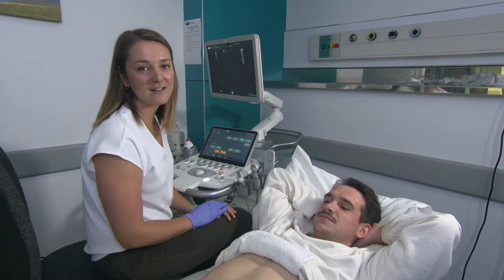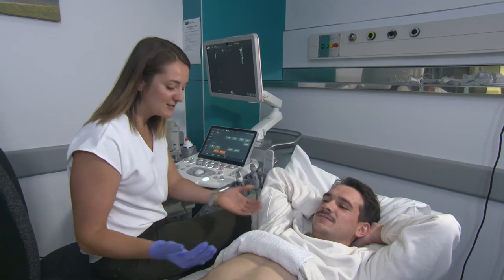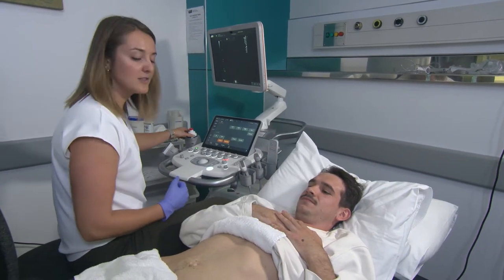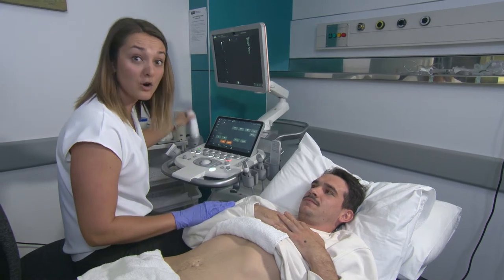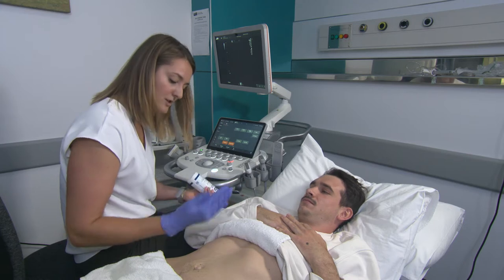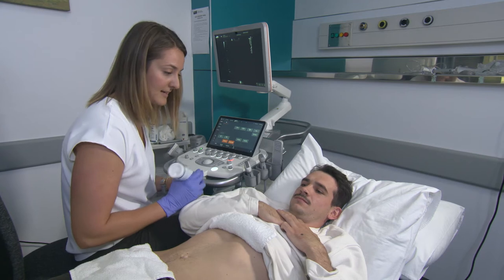Here we have our lovely volunteer, Bruce, who's going to be helping us scan. The first thing we want to do is make sure that our patient is nice and close so that our ergonomics can be good. I'm going to get you to scoot a little bit closer — perfect — and keep this arm just across your chest the way you have it now.